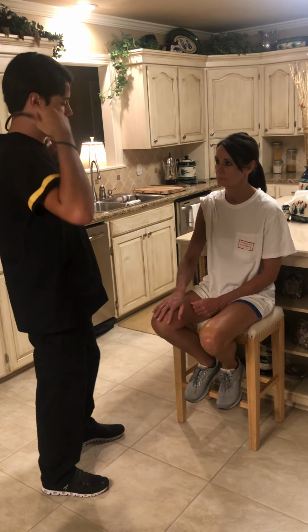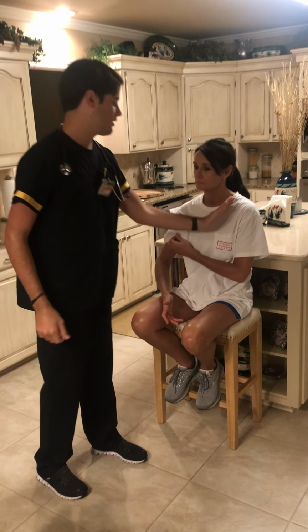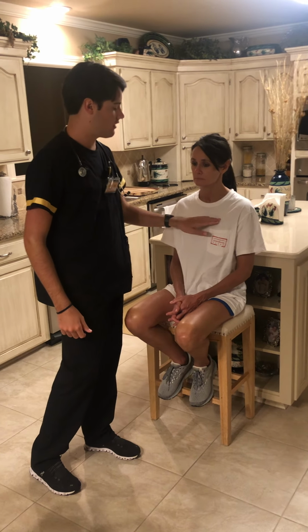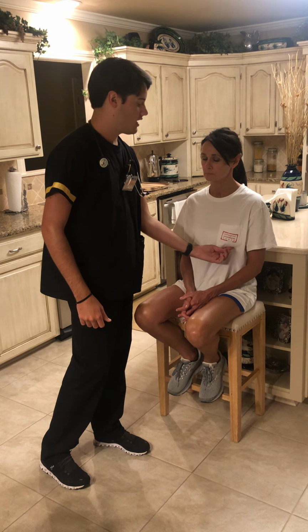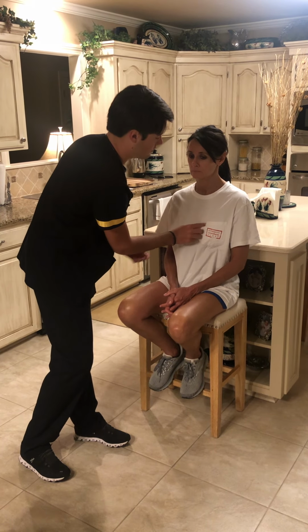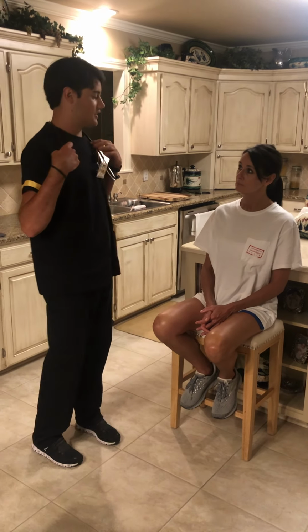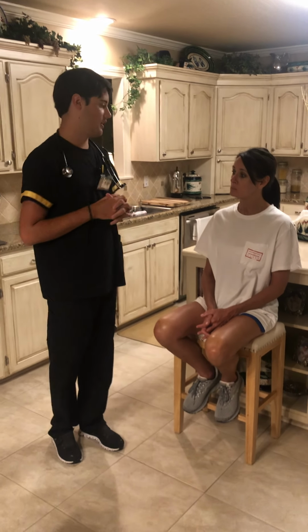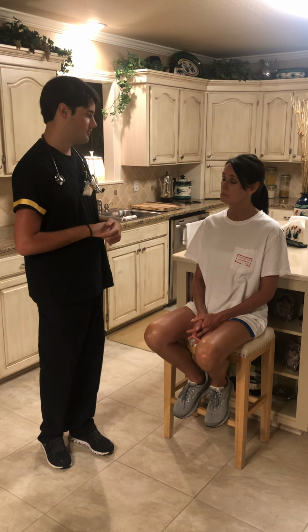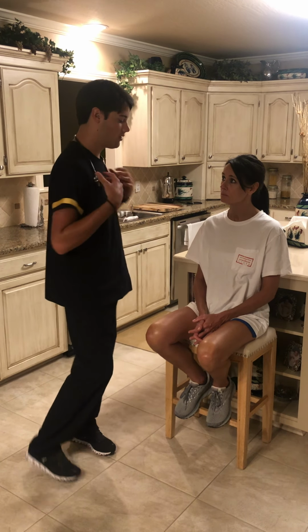So now I would assess the patient's apical pulse. I would get at the midclavicular line, go down 5 intercostal spaces, and I would auscultate right there, about 5 down the midclavicular line for 60 seconds. Let's say I did that, that would be between 60 and 100, or if it was less than that or higher than 100, it would be abnormal.